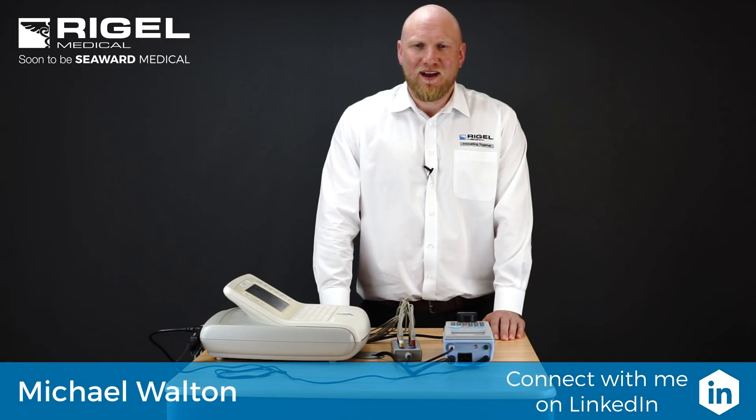Hi, I'm Michael Walton, Application Engineer at Rigel Medical. Today we're going to do a short video of electrical safety testing with the Rigel 288 Plus electrical safety analyzer.